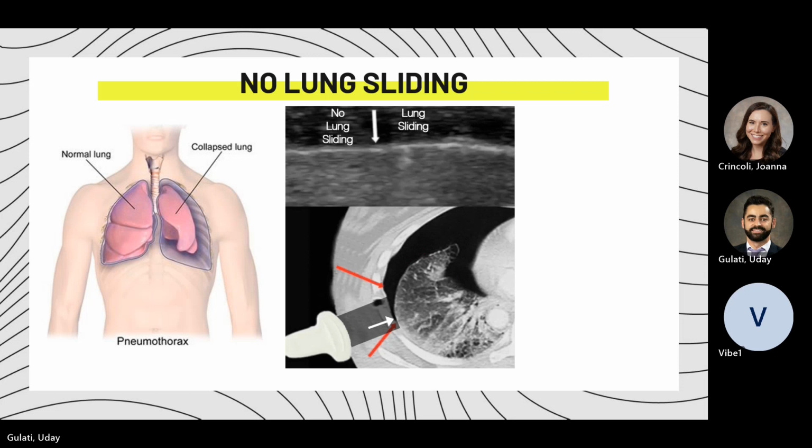And then you see that, okay, initially, if you can even slow this down by recording it, there's lung sliding, and then there's lack of lung sliding. It changes in and out. So you found the lung point, the point at which the pneumothorax enters the plane of view where the lung collapses, and then you no longer have sliding between the visceral and parietal pleura.